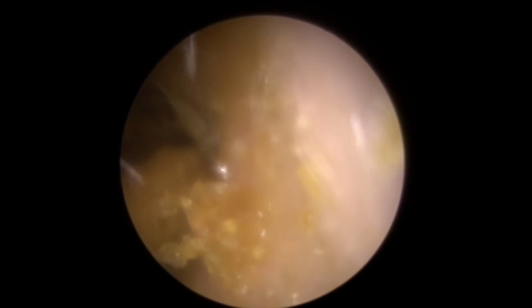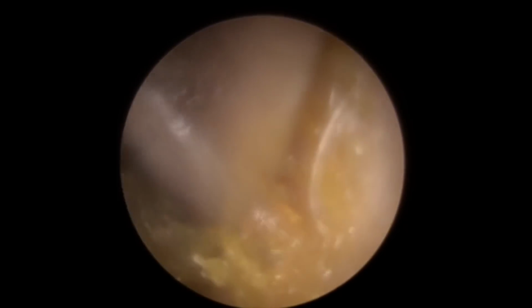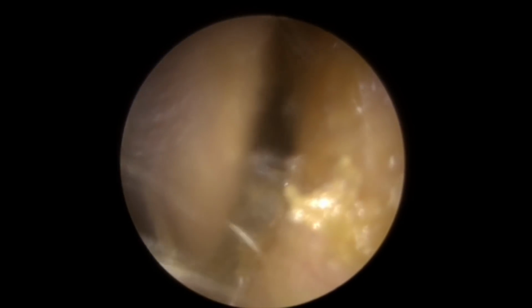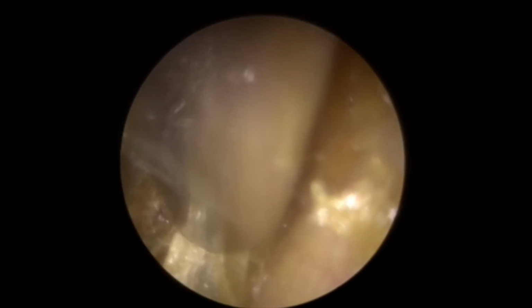A little bit difficult because the ear canal, the cartilage and the skin around the outside of the ear canal start to become quite loose and has collapsed in on itself. So we've got a very narrow entrance to the canal. Lots of dry skin here as well at the entrance. You can see that's been sucked into the machine. That's actually a layer of dry skin that's lifting from the canal wall.